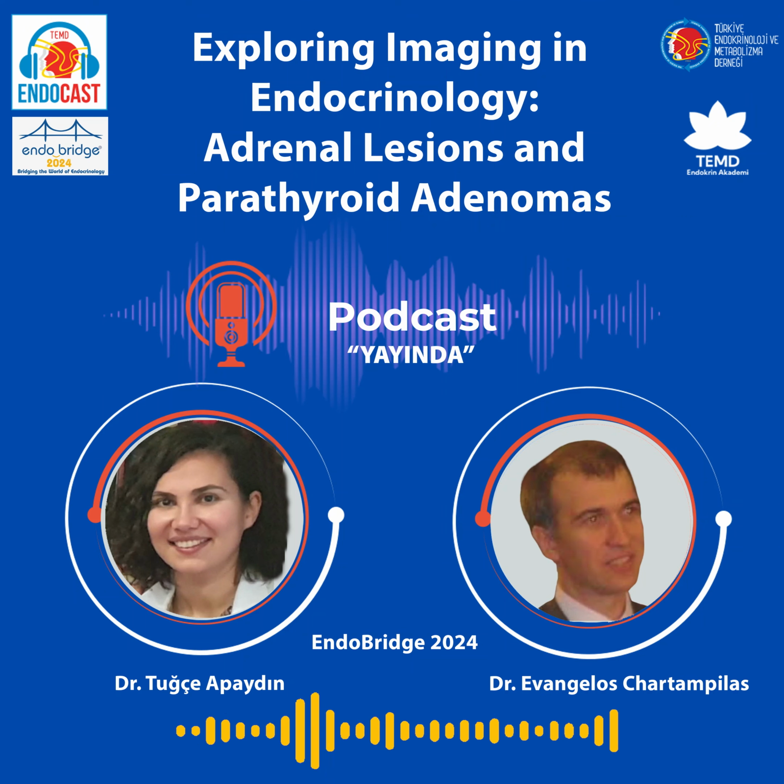Either of these can be diagnostic or non-diagnostic. I would lean more toward sestamibi as it has the capacity to retain the radiotracer. However, the radiotracer can also be seen in thyroid nodules. So I think the best approach is either to do a dual-phase sestamibi scan or a dual-isotope study by adding pertechnetate technetium and sestamibi, so in a single phase you can detect which is thyroid and which is parathyroid.